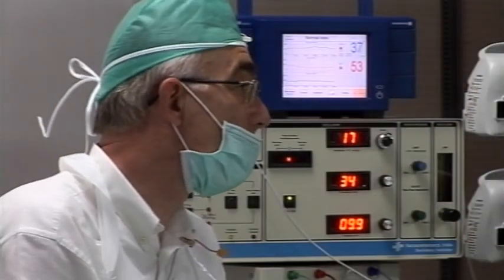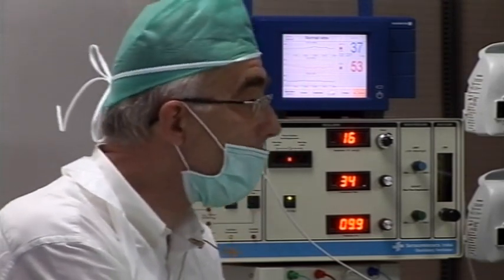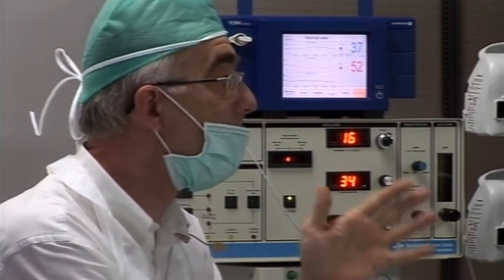Did you mean that if you mix CPAP and HFOV, the length of stay is even shorter? Absolutely. But you have to start with early CPAP, or early HFOV. Yes, I combine them, and remember what I want is to keep good oxygenation at lower than 30%. So if the baby spontaneously breathing needs more than 30% oxygen, I will start CPAP.